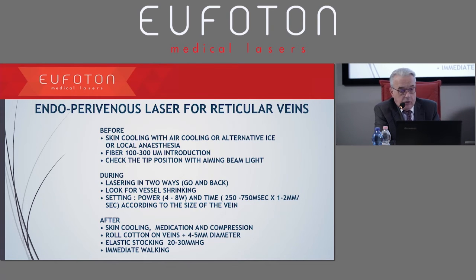The fiber is 100 to 300 according to the size of the small veins, and the position is identified through these accessories, which are transillumination or beam light.